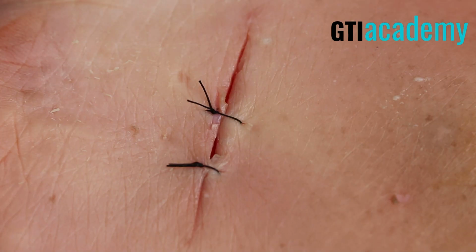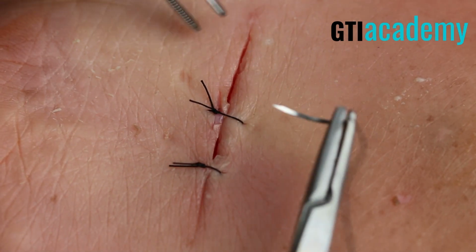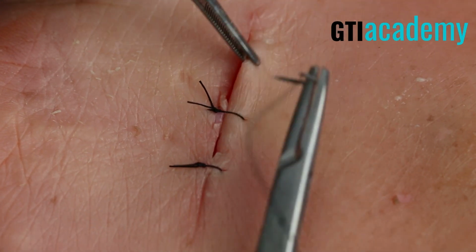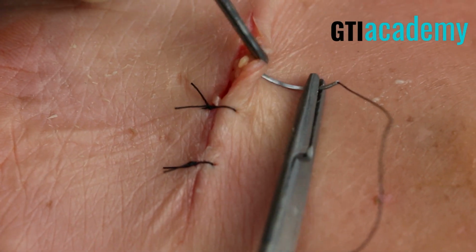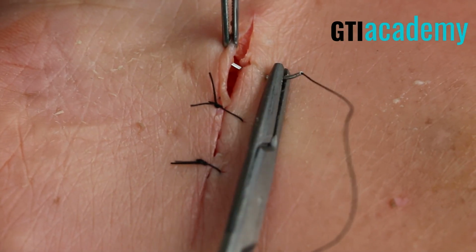Now, these loose ends, when I cut this suture, I'm going to look at the previous suture and try to make it as equal as I can. This will make the sutures look more aesthetic. Now let's move up to the top. Measure the top to the last suture, take the middle, throw another suture.